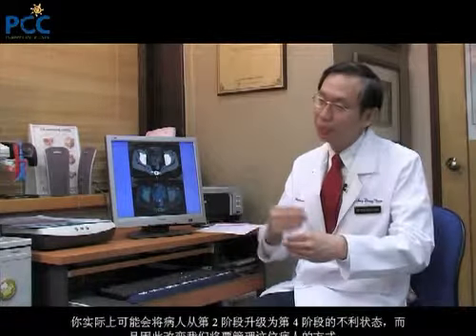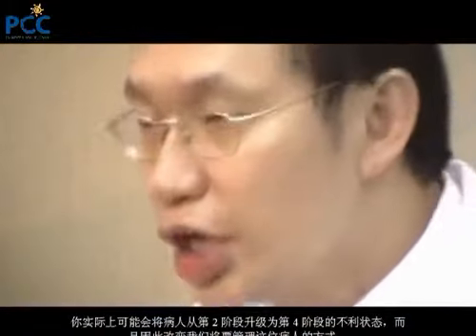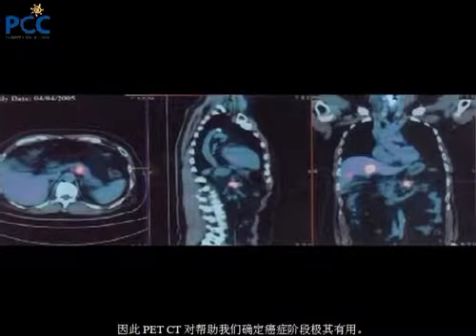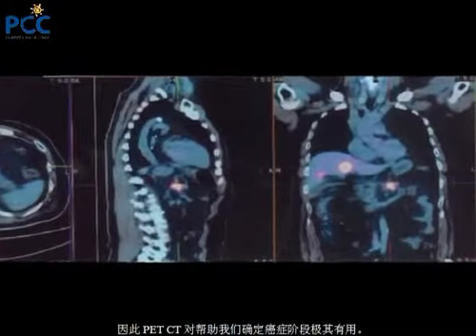You may actually upstage a patient from a stage 2 to a stage 4 and thereby change the way in which you're going to manage this patient. So a PET CT is extremely useful in helping us to stage the cancers.